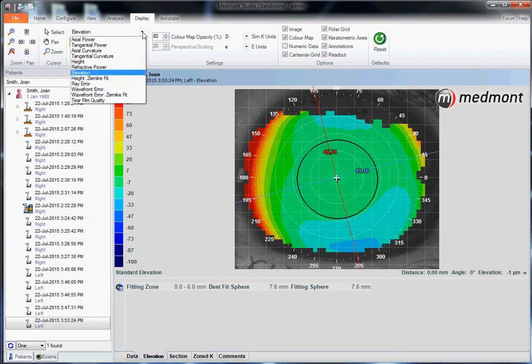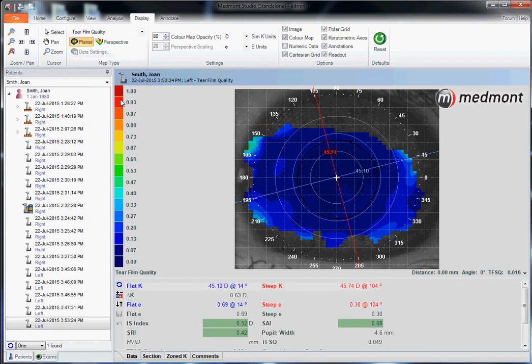We could interpret this topography based on the tear film quality. We see this dark blue color covering the vast majority of this image. This indicates that the tear film on top of the surface of the cornea was very smooth. Dark blue indicates smooth placido reflection. If we saw hot colors, then that would be indicative of tear film breakup or dry eye.